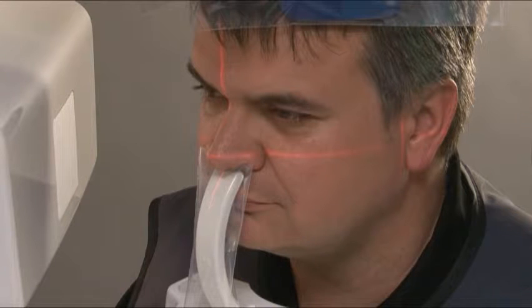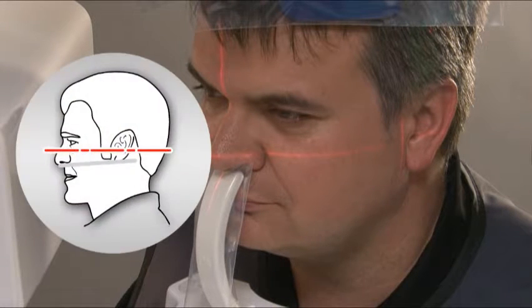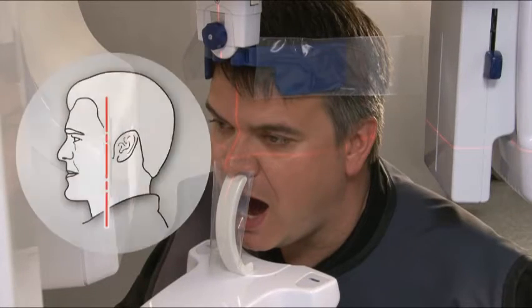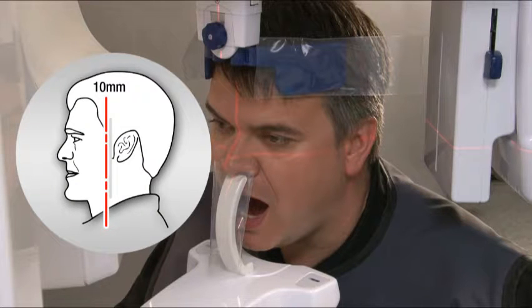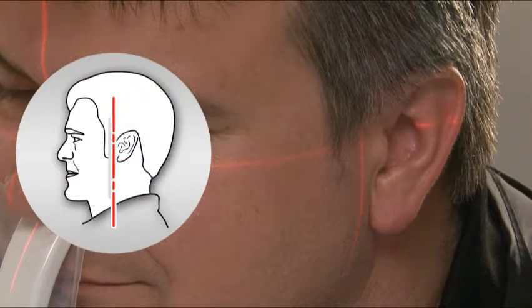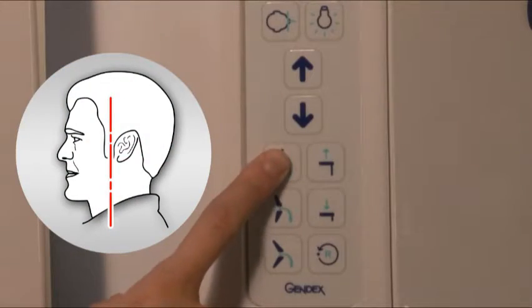For TMJ horizontal placement, use the up-down buttons to bring the patient's Frankfurt plane parallel to the laser. For open TMJ lateral vertical placement, adjust the position of the TMJ laser until it aligns 10 mm anterior of condyle. For closed TMJ lateral vertical placement, adjust the position of the TMJ laser until it aligns in the middle of condyle.